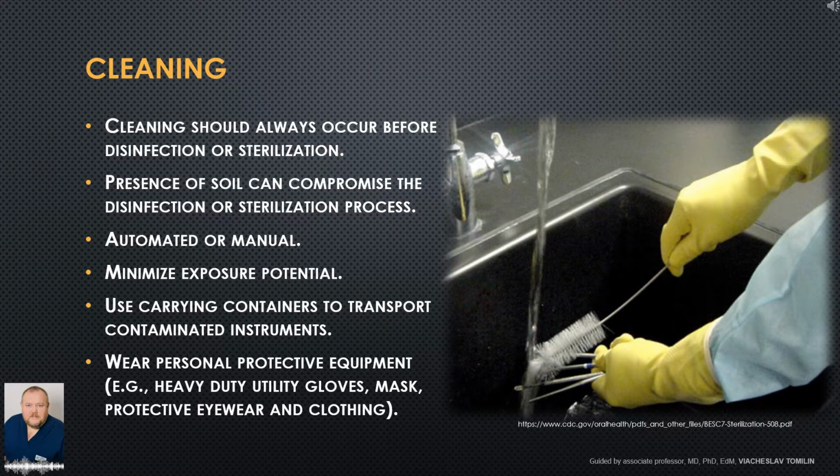Cleaning. Cleaning should always occur before disinfection or sterilization. Presence of soil can compromise the disinfection or sterilization process. Cleaning can be automated or manual. Minimize exposure potential. Use carrying containers to transport contaminated instruments. Wear personal protective equipment, for example, heavy-duty utility gloves, mask, protective eyewear and clothing.